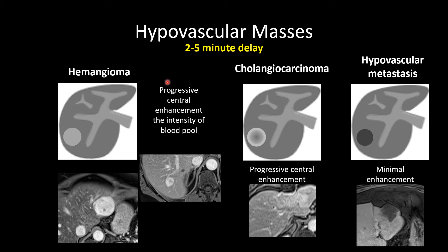Moving to the two to five minute delay, you will see continued progressive central enhancement within the hemangioma, which is now homogeneously or near-homogeneously enhancing. The enhancement of the hemangioma is very similar in signal intensity to blood pool. For the intrahepatic cholangiocarcinoma, there is also progressive central enhancement with near-homogeneous enhancement of the mass, but that enhancement is actually less than blood pool. The progressive central enhancement within the cholangiocarcinoma is partly due to the fibrotic nature of the tumor and third-spacing of gadolinium into hypovascular regions of tumor, allowing gadolinium to accumulate over time.